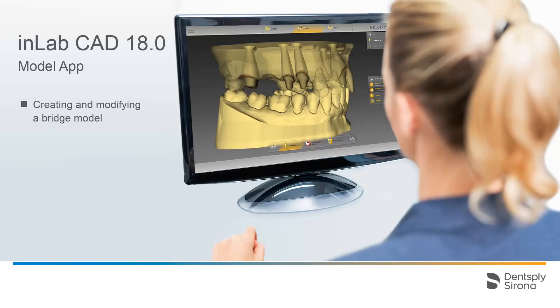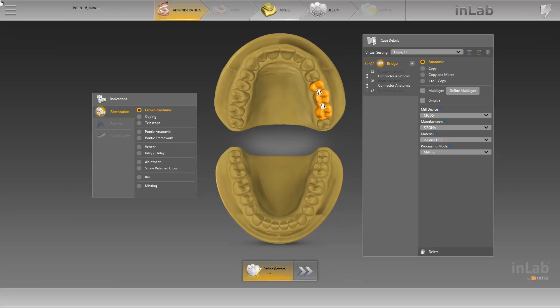Welcome to this video tutorial on the topic of creating a model in case of a bridge restoration. In this video, you will learn how to create and design a model. In our example, we have already imported the necessary model data via the Sorona Connect portal and created a corresponding case in the administration phase.